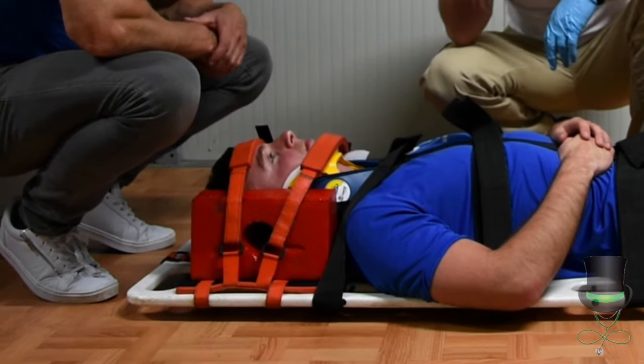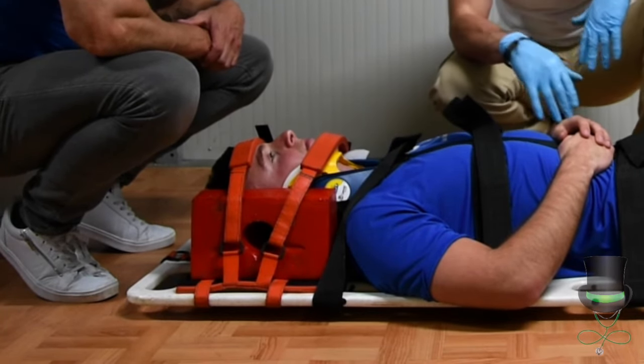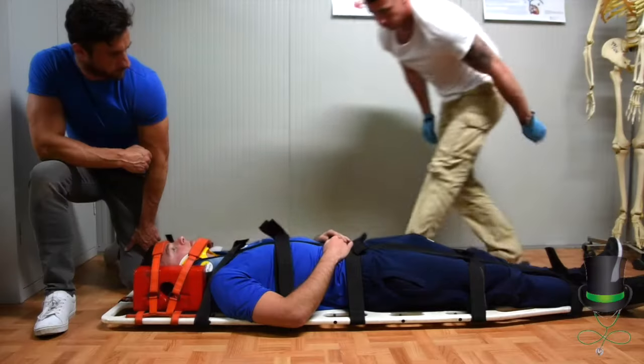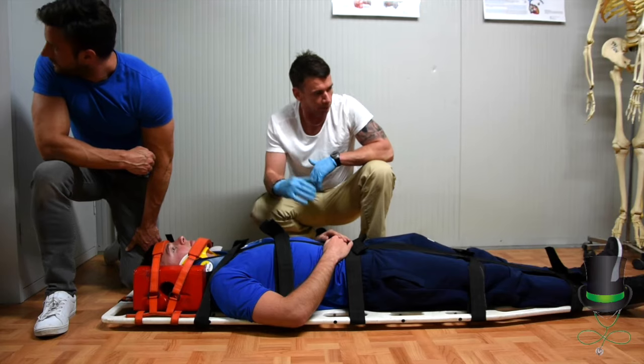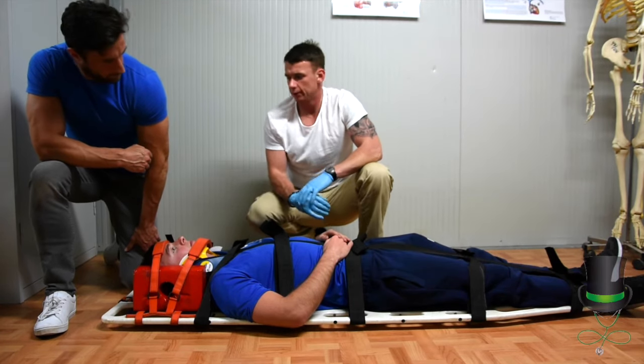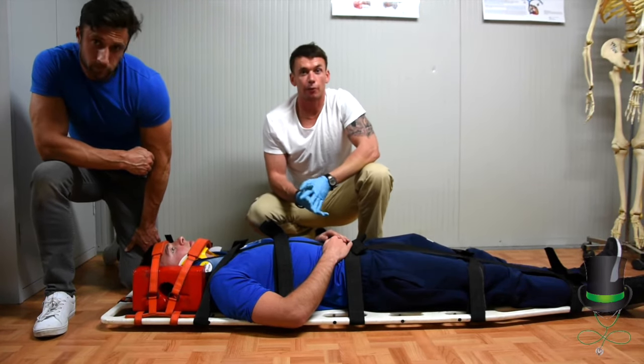Perform CSM checks — circulation, sensation, and movement — before and after all splinting. When checking the lower limbs, be sure not to tickle the foot, as the patient may react by pulling away their leg. This concludes how to put someone on a spinal board.